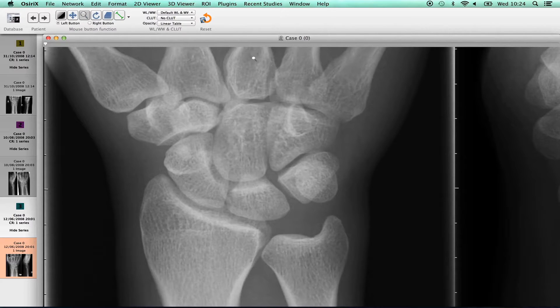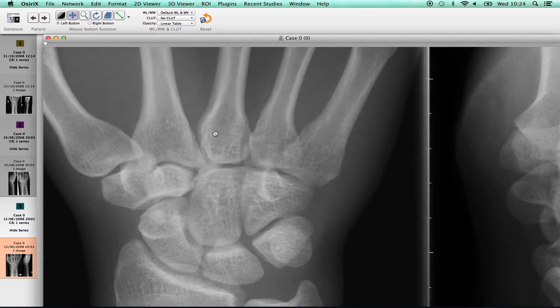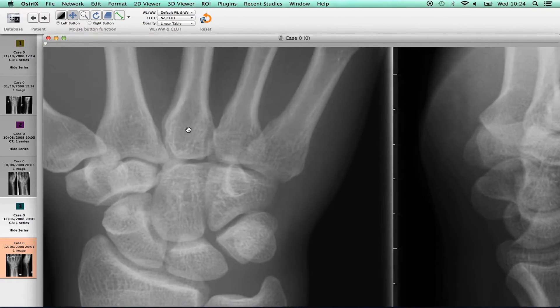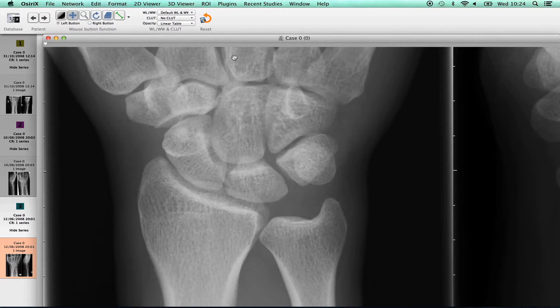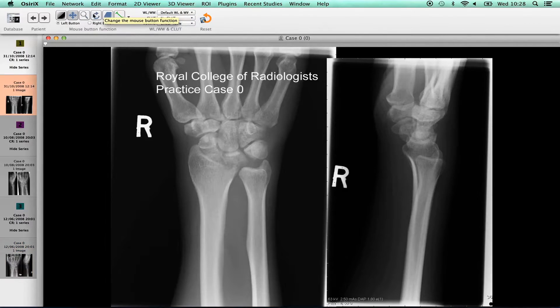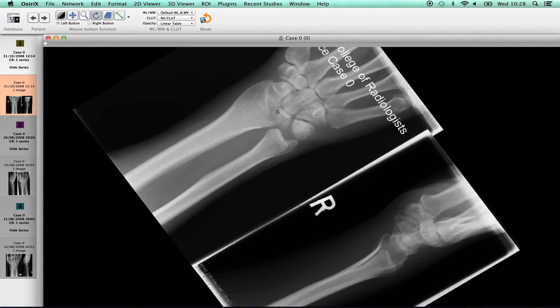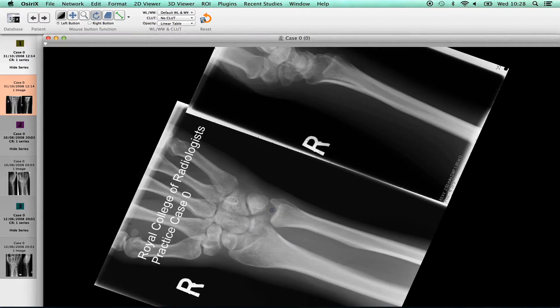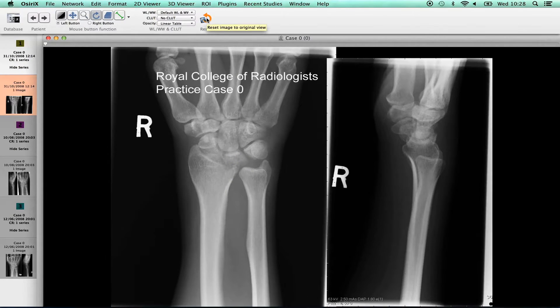Clicking the cross button provides the ability to pan and look at the image in more detail. To revert to the standard view, just click the reset button. Candidates can rotate the image by clicking on the circular arrow, holding the left mouse button down and then moving around the image. Again, to revert to the standard view, just click the reset button.